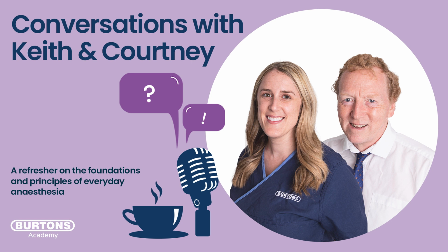So it could have become completely apneic a while ago, or its tube could have come disconnected under the drape a long while ago, or blocked, or whatever, some time ago. And that's another good point you just made about the ET tube being blocked. When we talk about why delivery is not happening in our patient, is the head kinked? All of these things fall into place.